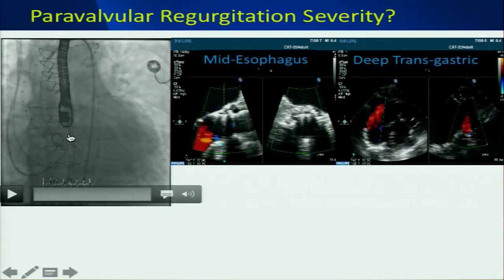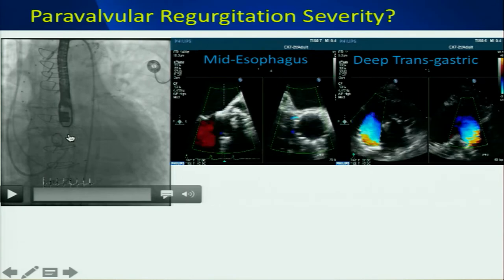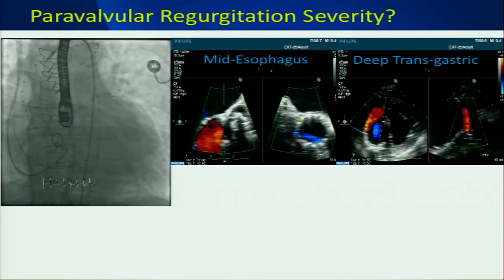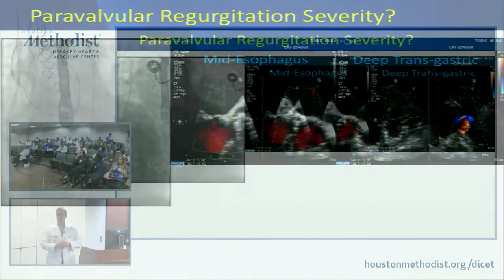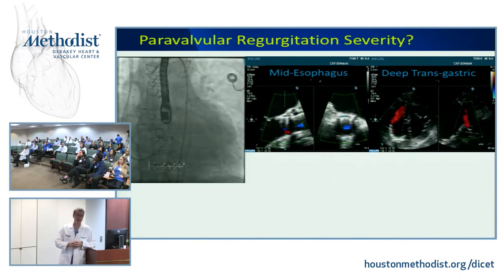You can do X-plane with transthoracic. Yeah, so I mean, sure. For the reference in the room, this should really become almost routine for you guys. Yeah, absolutely. X-plane or 3D is not a TEE thing. It was present by transthoracic 8-9 years before it was present on a TEE.